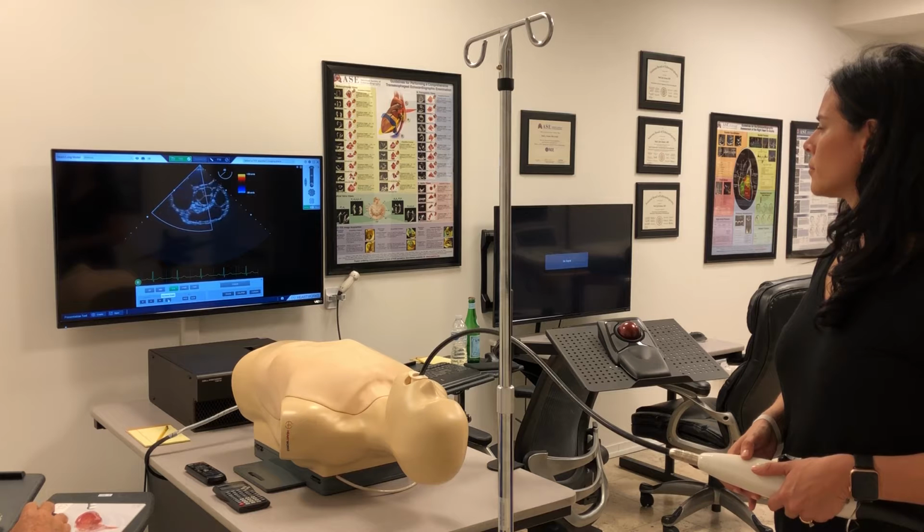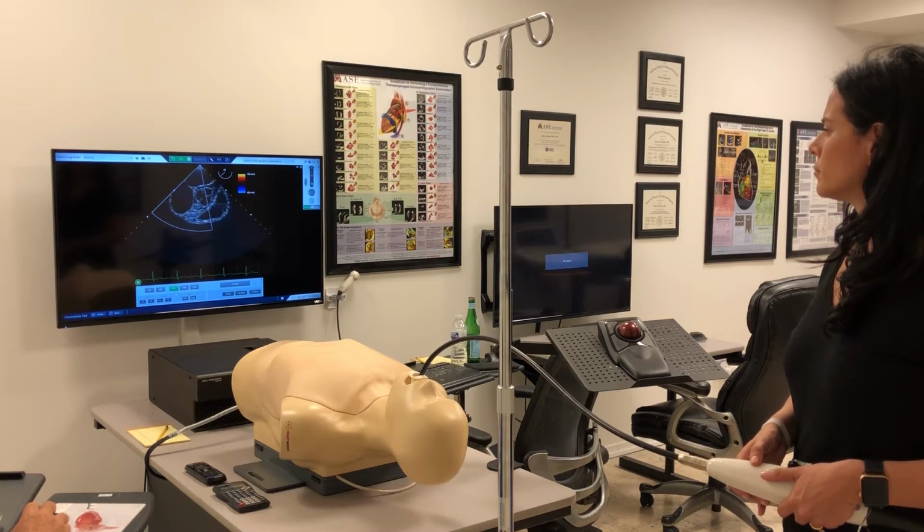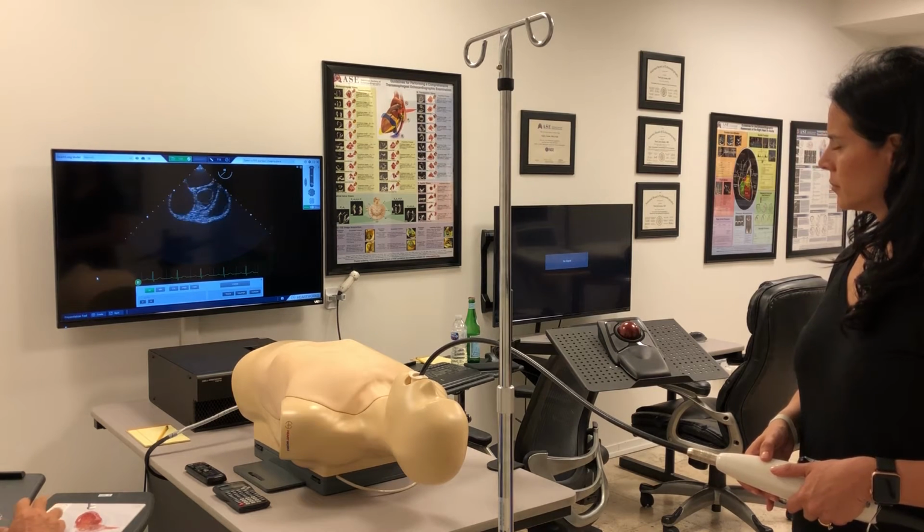So we've effectively, at least in this view, ruled out PFO and ASD. When you're done with the lower Nyquist limit, you have to remember to always elevate it. So let's bring it up: 30, 40, 50, 60. And that's so you don't overcall any regurgitation on subsequent views. I'm going to turn off the color. We're going to go to the next view.